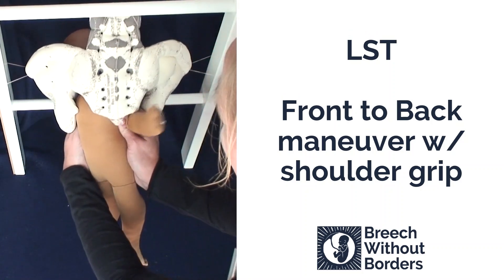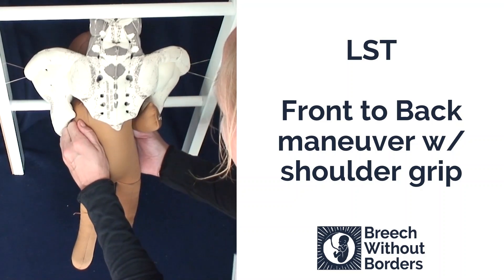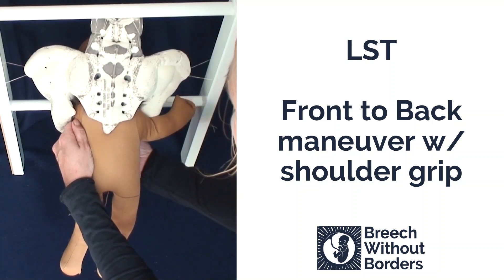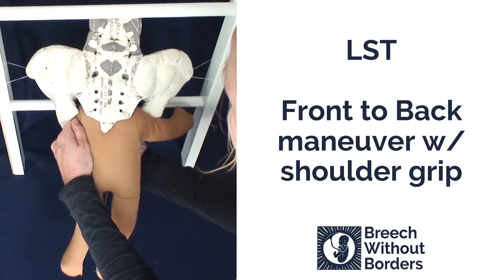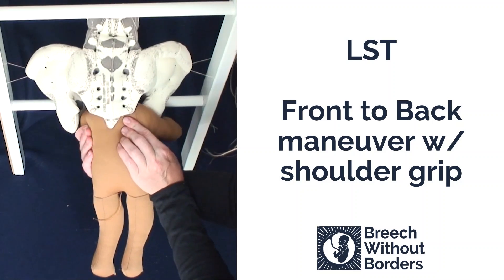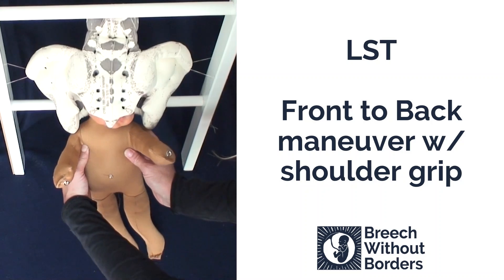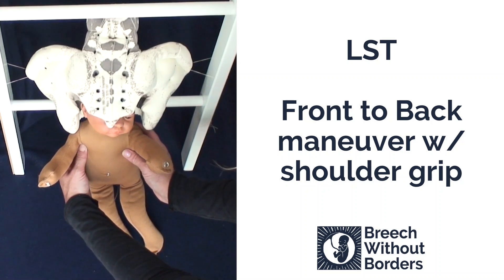Disimpact. Rotate 90 degrees to sacrum posterior so the baby faces the mother's pubic bone. Sweep down the anterior arm with your bottom hand. Grab the shoulders again, and rotate 180 degrees back the way you came from, so the baby faces sacrum anterior.